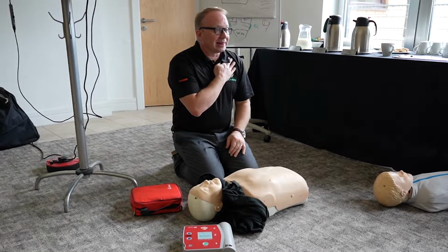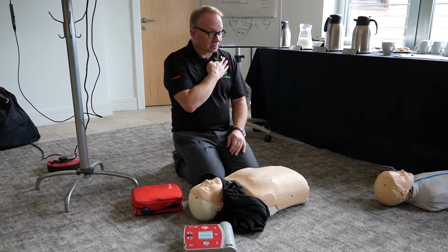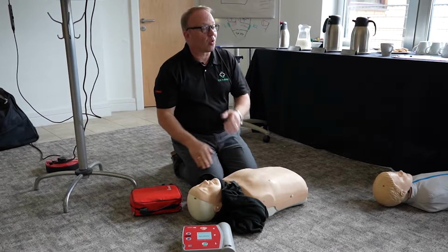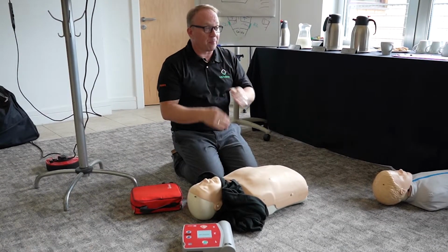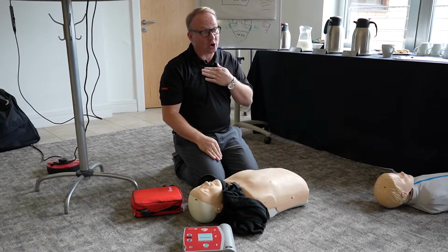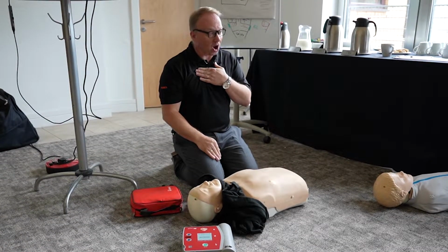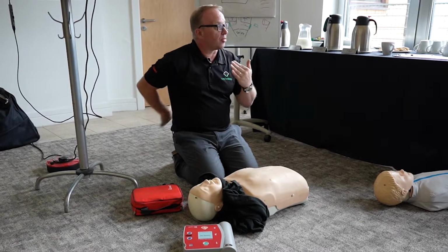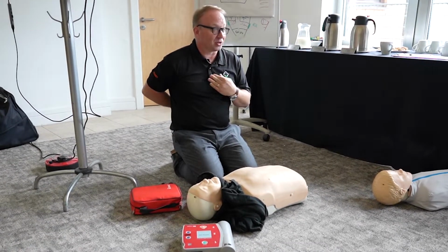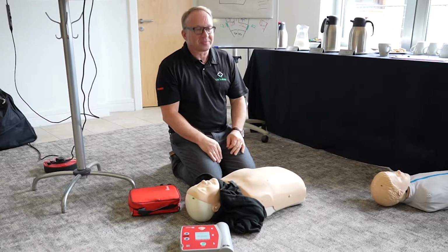Pacemakers are placed on the left side in hospitals. These pads go on the right side. On the odd occasion, a pacemaker may be placed slightly over to the right side, because they do. We can place the pads on the front and on the back, so they're not anywhere near. Anything else?